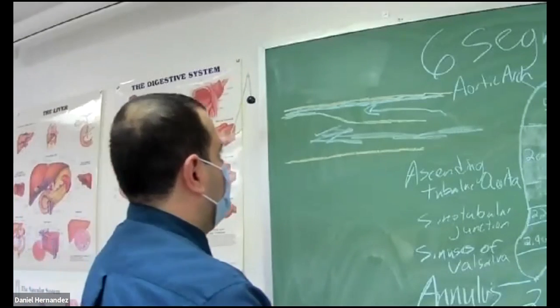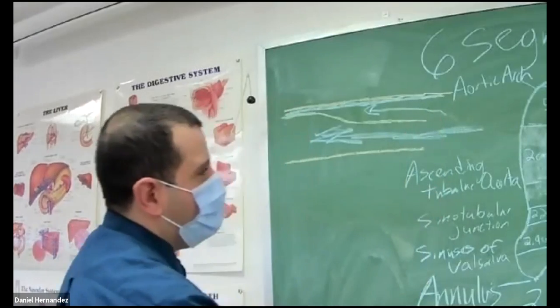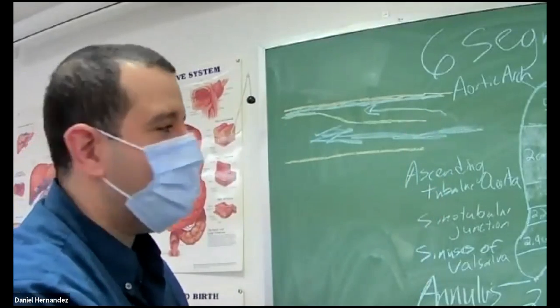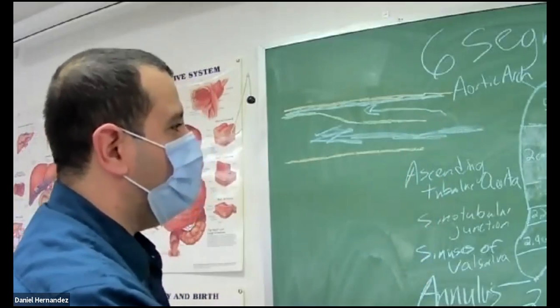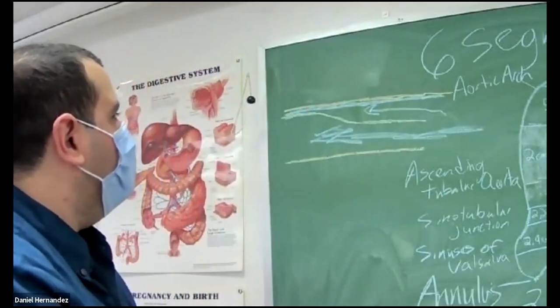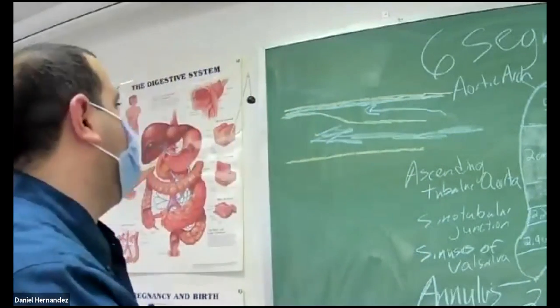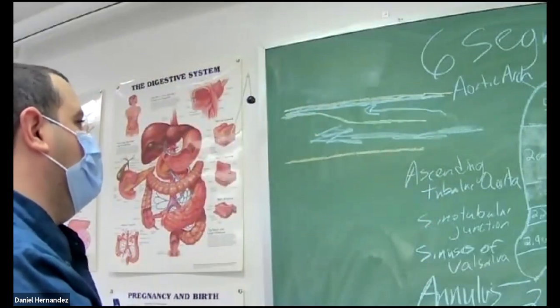And when you Doppler, particularly when we're doing carotids and looking for a dissection, it's much easier to see a dissection on a carotid just because it's so much more superficial and we're much closer. It's harder on ultrasound, on echo. But granted, the vessels are bigger on echo, so you could potentially see it as well, or you are going to see it as well.